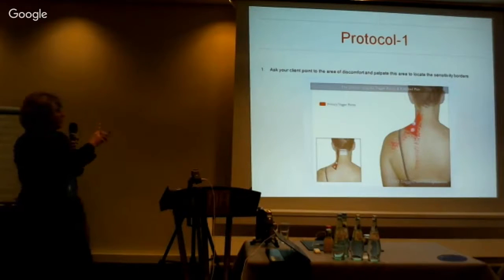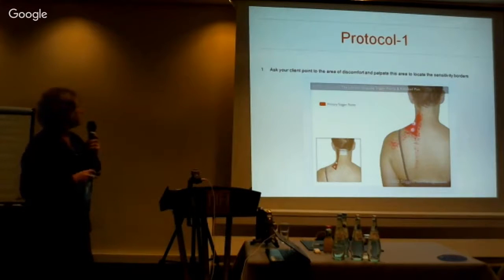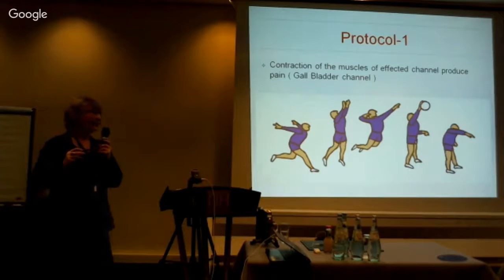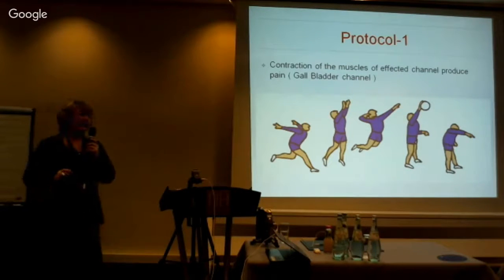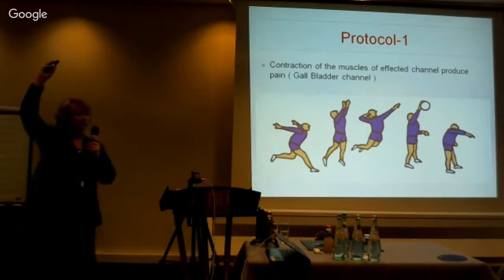So it's just showing you what you do. It's the same thing which I did before. You find the place. If the patient cannot show you the real place, and says it's somewhere around the shoulder, you can ask him to do the movement which makes it painful, and according to the movement, you will see which channel might be involved, right?